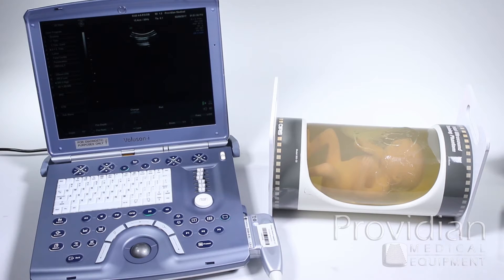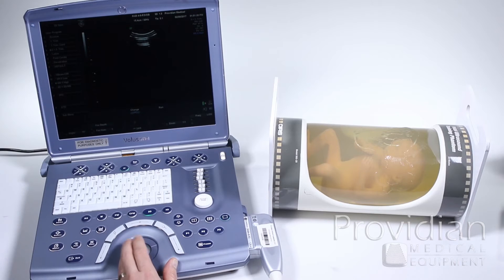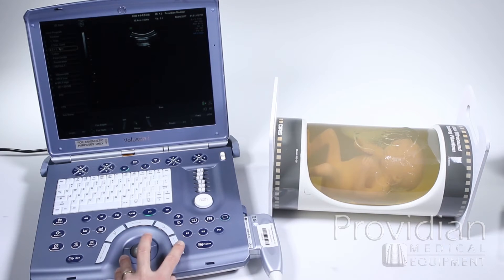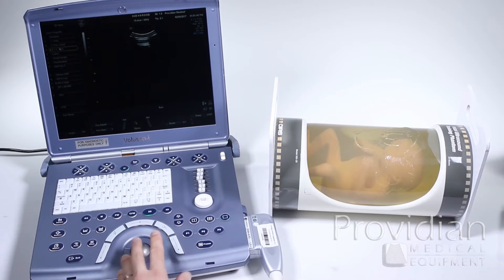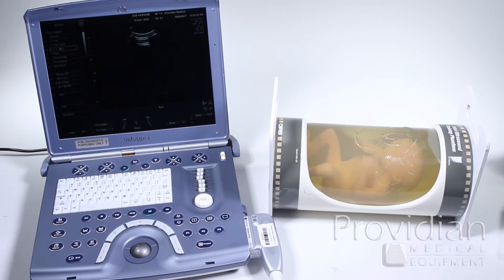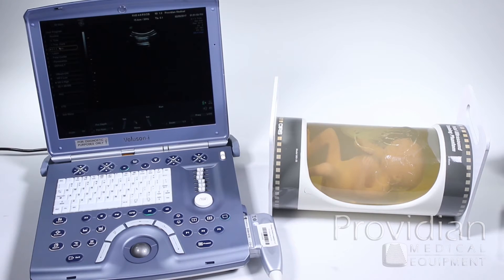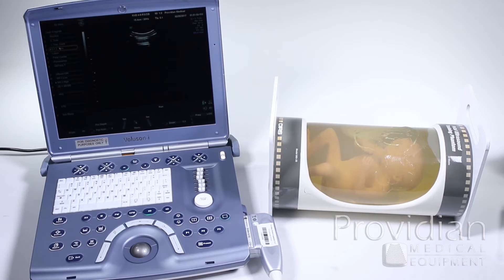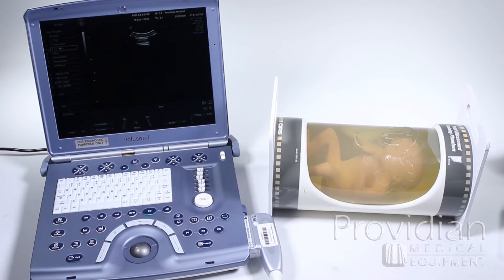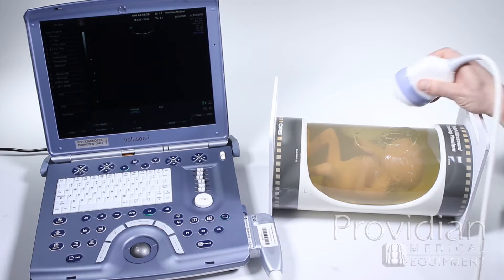On all Volusons, there's going to be some sort of setting with 2nd and 3rd trimester. I can see that over here and I'm going to choose 2nd and 3rd trimester. There might be a second trimester option on there, but you want to take that one — it's going to be the catch-all, most frequently used setting for 4D imaging. So you first select that and you want to get an image of the baby's face.